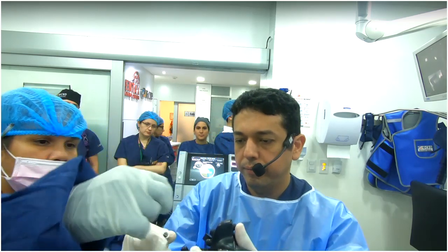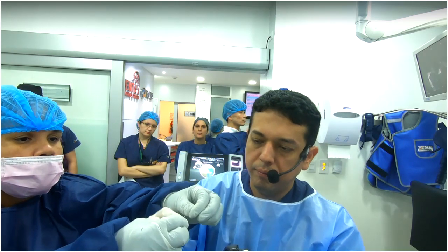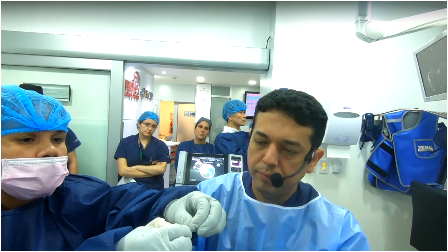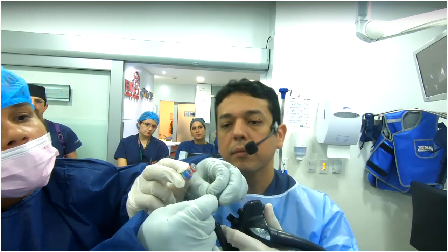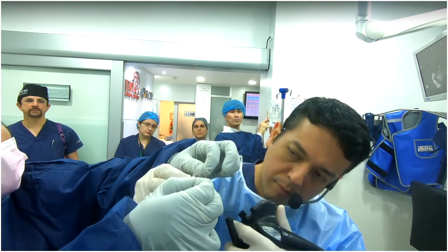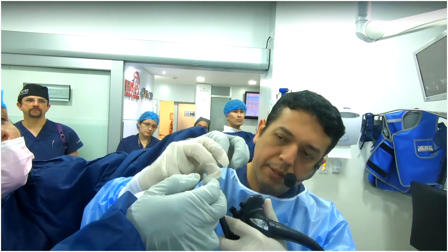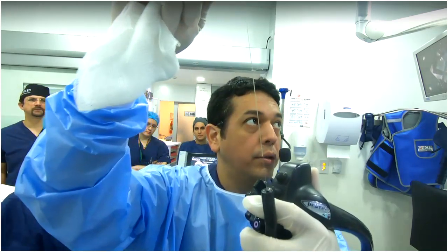Now we open, and we pass in the middle. And now it's okay.